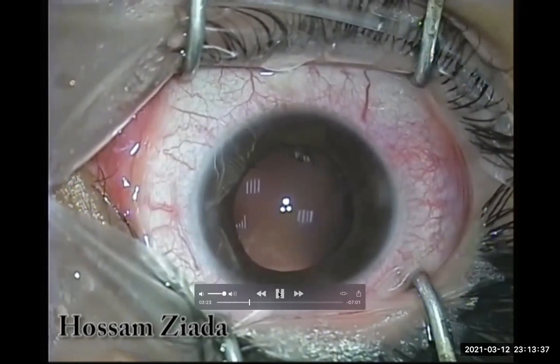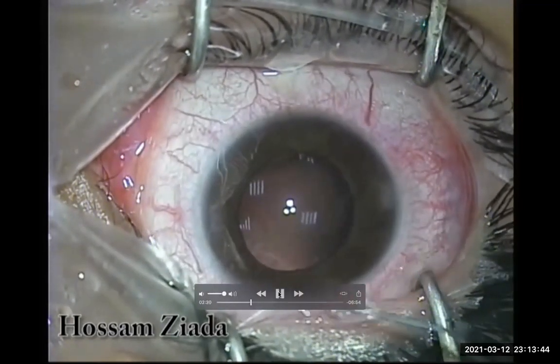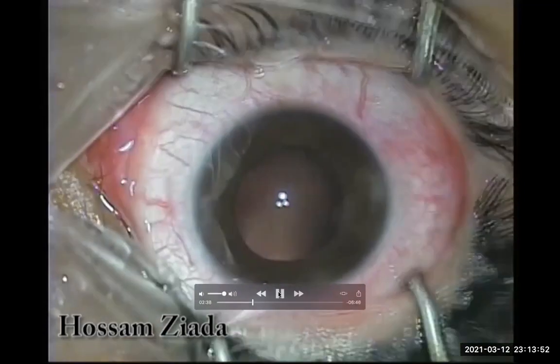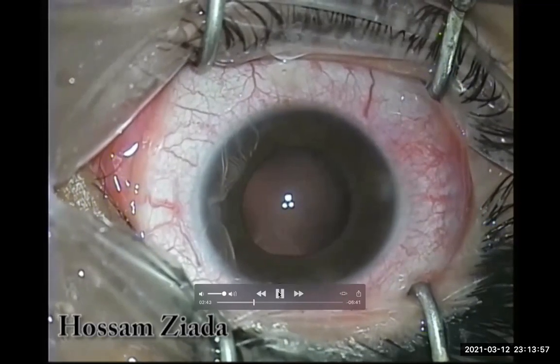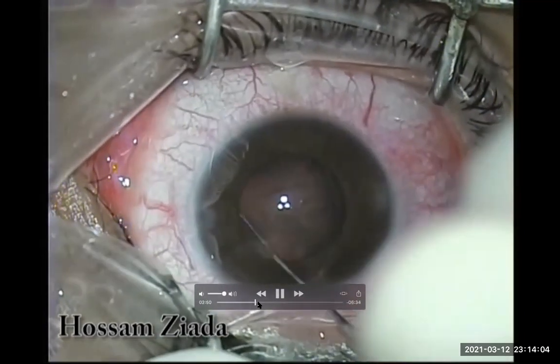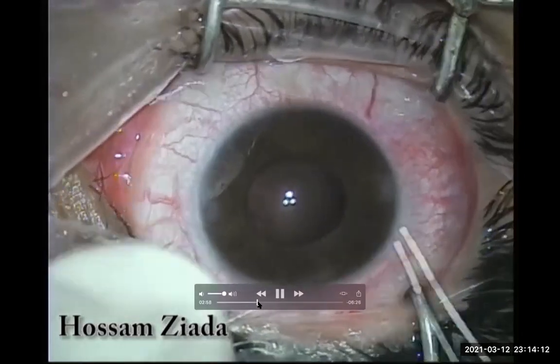I took the decision to implant an intraocular lens in the same session. I was considering Agarwal's technique with externalized haptics or a Yamane technique, but I preferred in this case to place a sulcus-fixated iris-sutured three-piece IOL using a one-pass four-throw prolene suture technique.